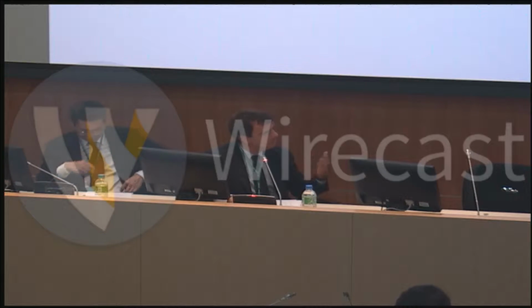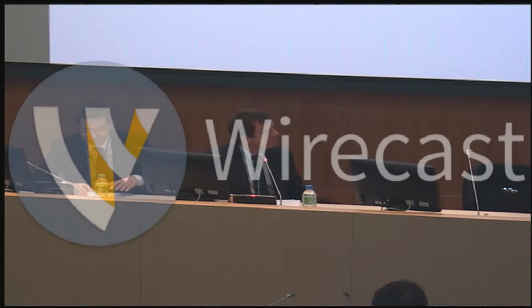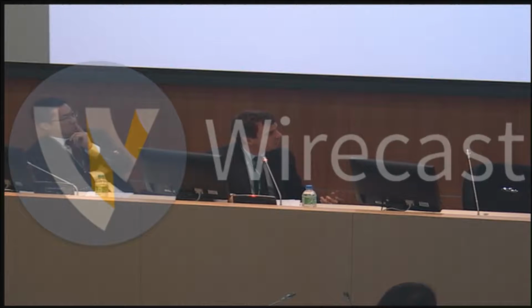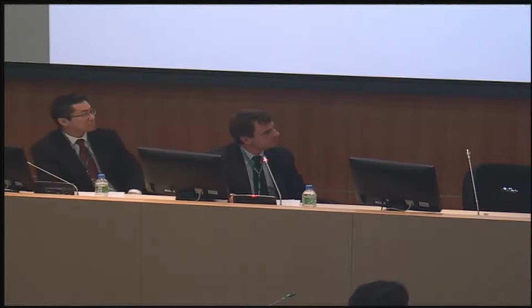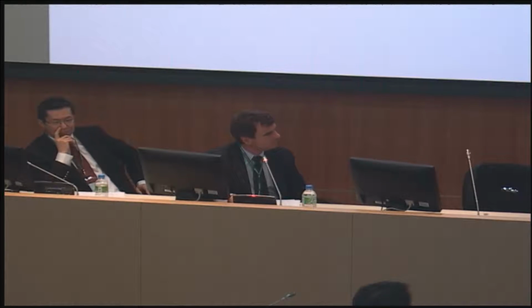Okay. And between these cutting accessories, what do you use in your routine? Everything, or do you have a selection? Do you have a preference? It depends on the location and the organ. For esophageal and colorectal ESD with a very thin submucosal layer and muscle layer, we basically use a Flush Knife because I'm working after Toyonaga sensei.